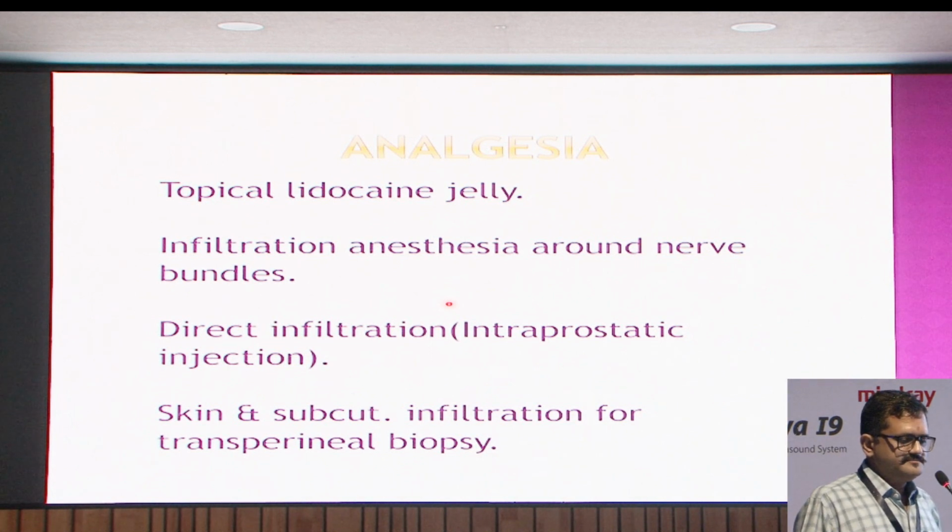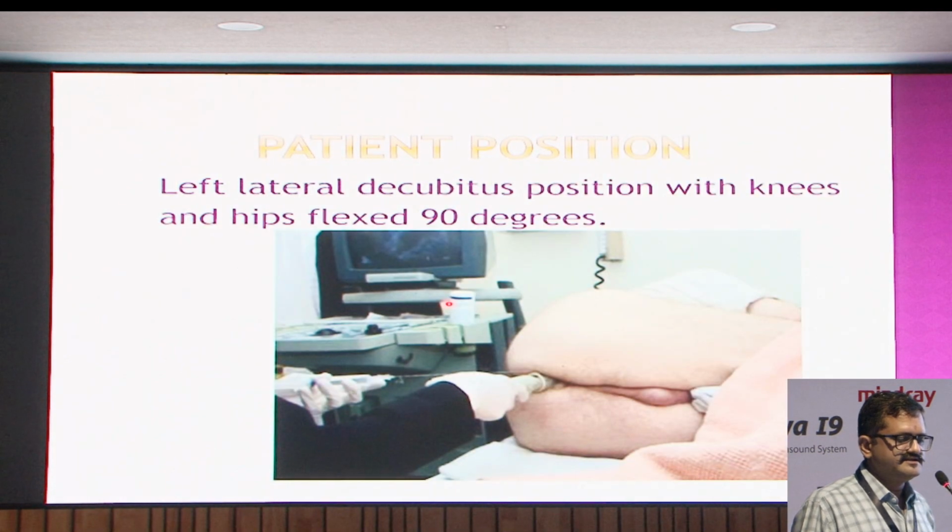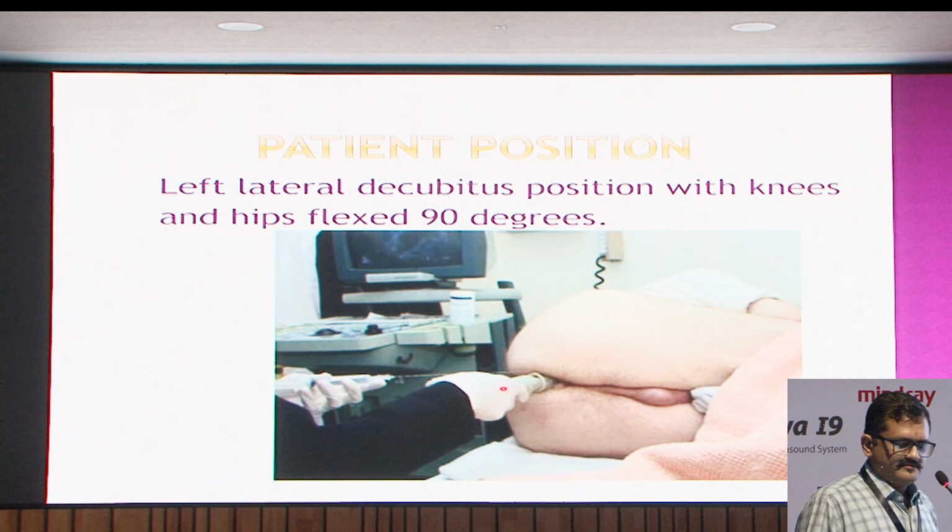Now coming to patient position, the patient lies in left lateral decubitus position with knee and hip flexed at 90 degrees. Before starting the procedure, the perianal area, perineal area and adjacent buttocks are painted with betadine and thoroughly cleaned.